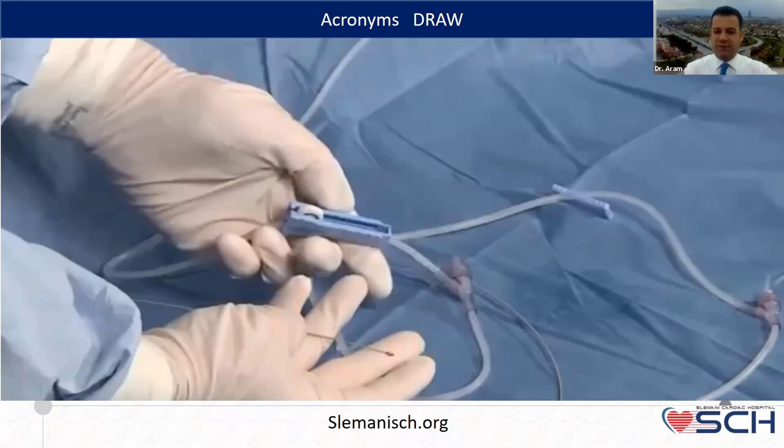Now everything is ready. We have prepared everything. The gas tank is attached to the console, from the console to the advancer, and now we're working on the patient.